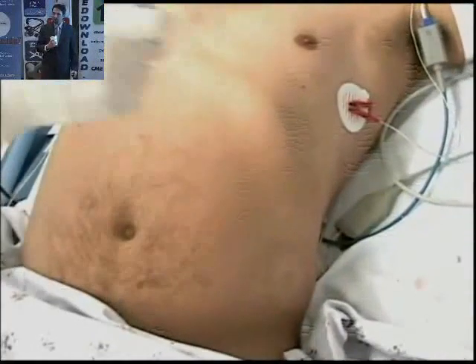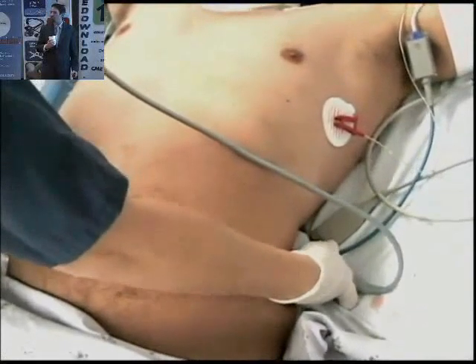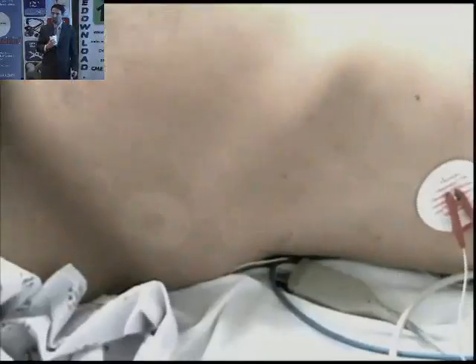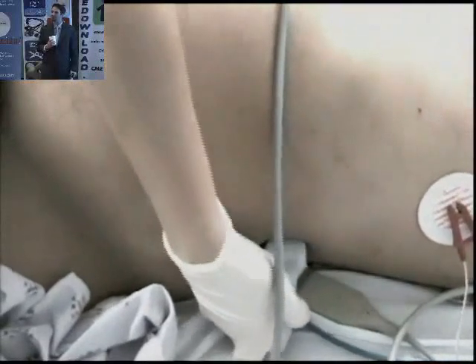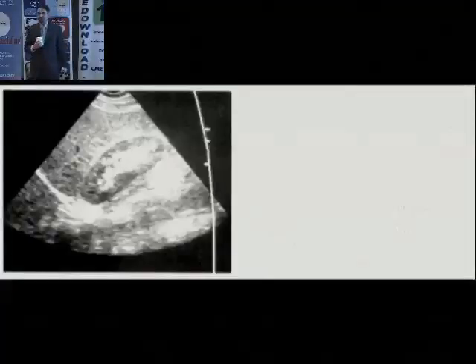On the left side, you really have to get your hand down pretty low. The spleen is much less forgiving, and the kidney can be tucked up pretty hard to find. This image just illustrates how far you might have to push your hands down. You're actually indenting the bed, the gurney, with your knuckles here. You're pushing deep down in there.